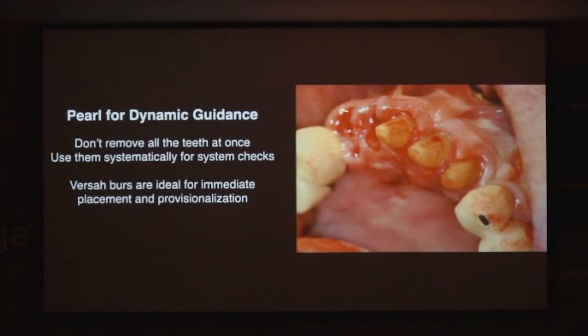And you look at the soft tissue. I'm not really hardly touching the soft tissue. Sometimes when you put a static guide on, the soft tissue gets in the way, doesn't it? So you don't need to do anything you used to do when you were completely freehand with dynamic navigation. You can go one tooth at a time if you want to. Okay? So you've got to remember that many of the things you did with static guides you were forced to do by their system. When we get to the bone reduction guide, I'm going to make that a little more obvious.